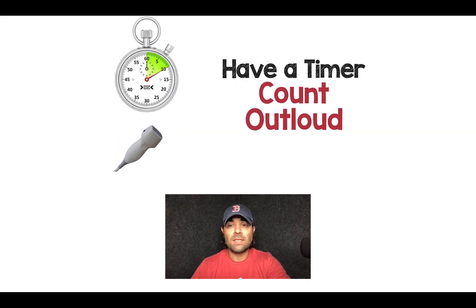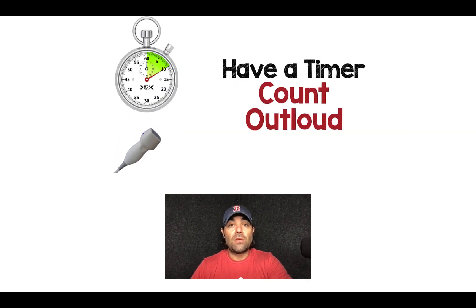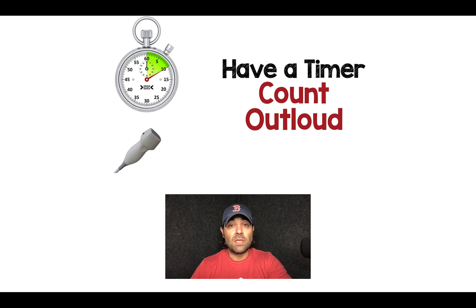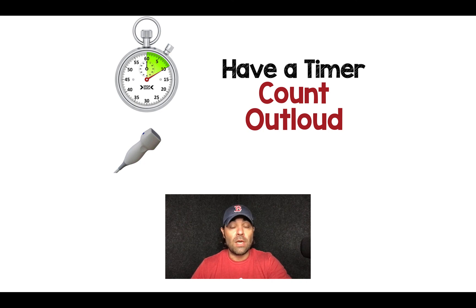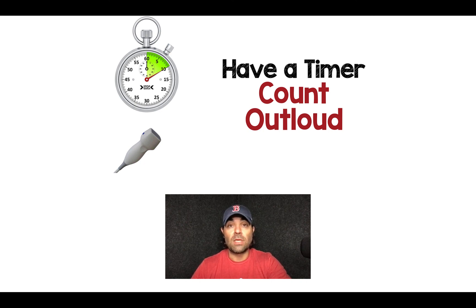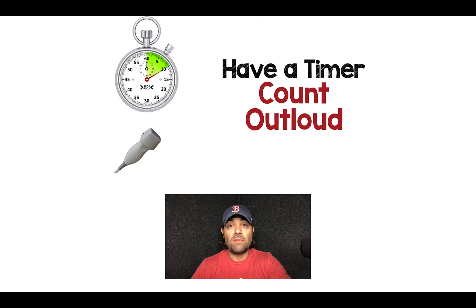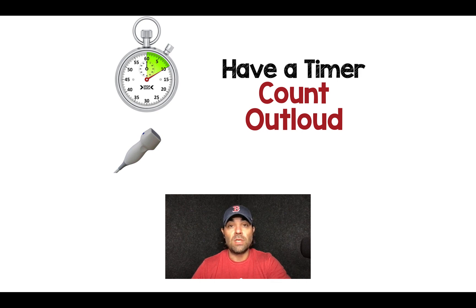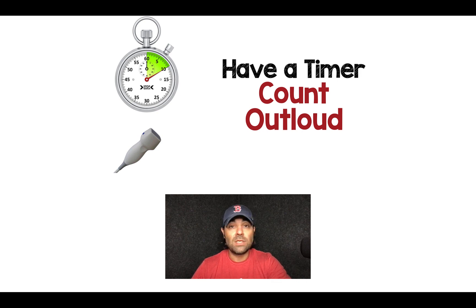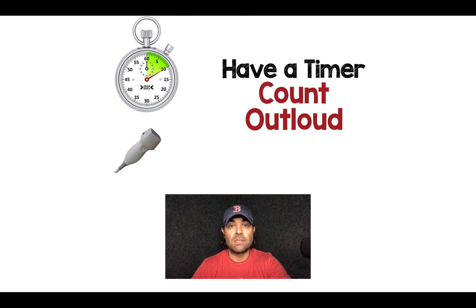The second thing is: have a timer — either a person that counts out loud, or an actual timer that counts out loud. If you've gotten the views you needed, or you haven't gotten the views you needed, once you hit 10, you're right back into CPR.